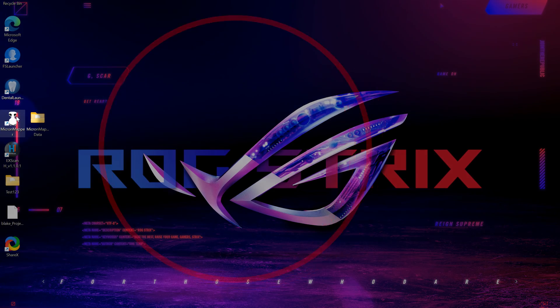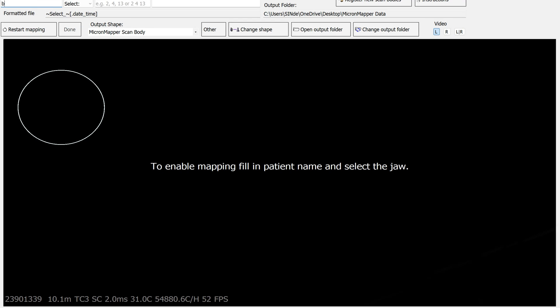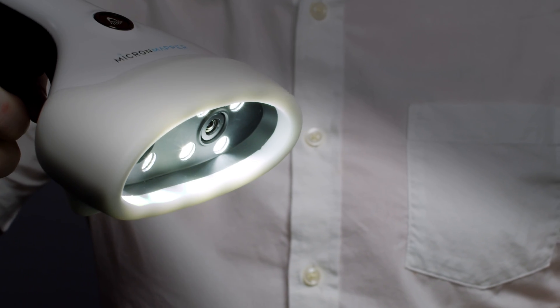Now let's get into the hands-on part. We'll begin by double clicking on the Micron Mapper icon. The next step in the scanning process will be to pick up your Micron Mapper, press the button located on the top side of the device to turn the light on, and point it at your model at a distance of roughly 10 inches.